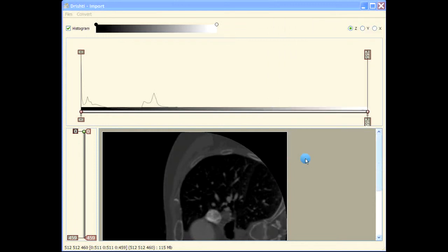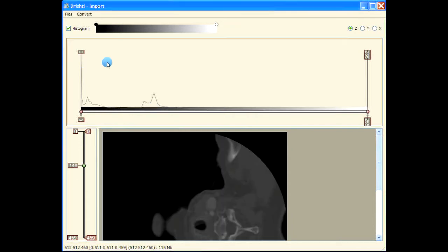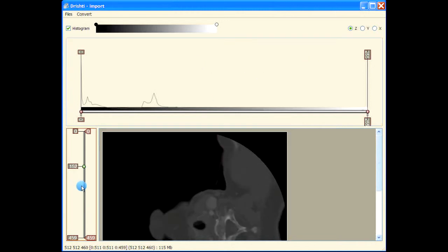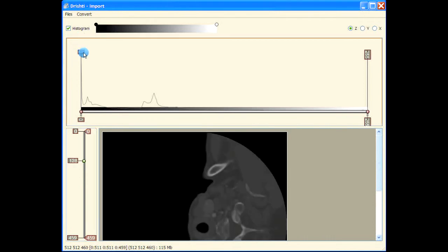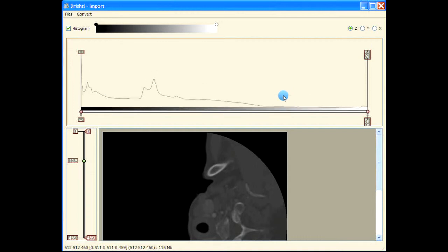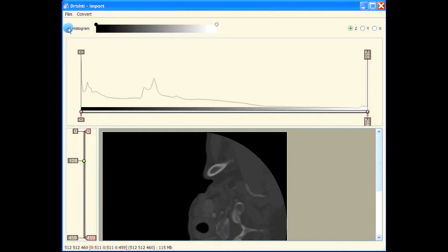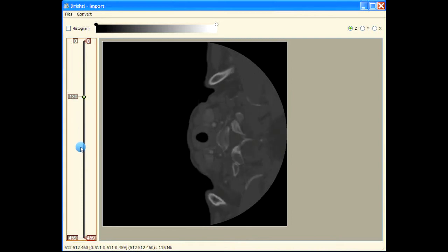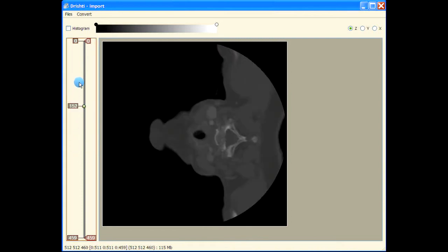Now that we have loaded this data, this is the histogram of the data. This data looks like it is single byte because the minimum value in the raw data is zero and maximum value is 255. Here I'm using up arrow and down arrow key, or you can use shift key to scale the histogram. Here I'm turning off the histogram bar and just going through the dataset.